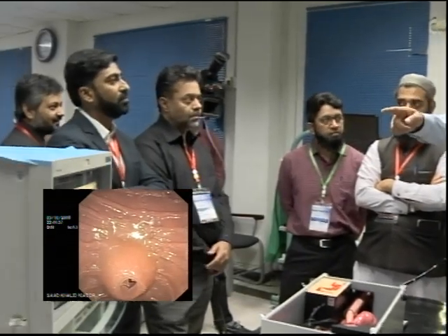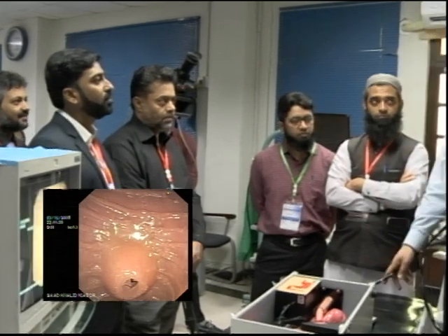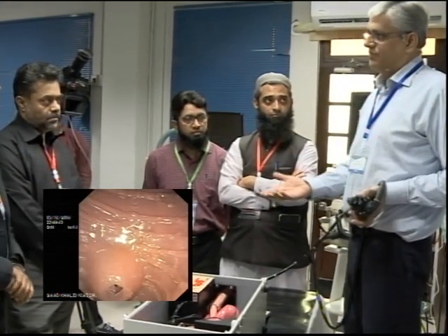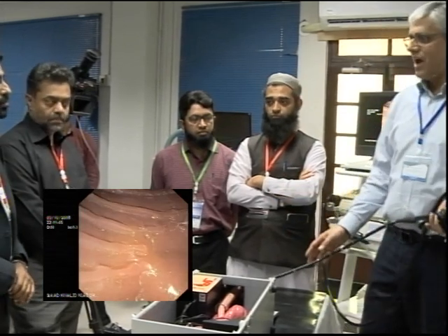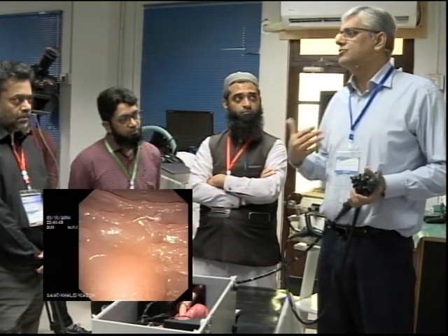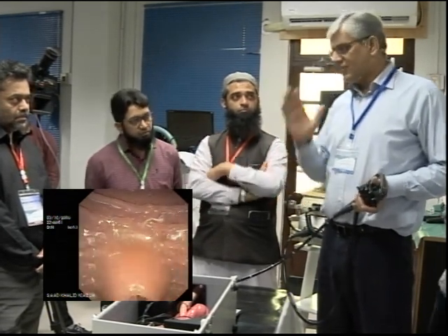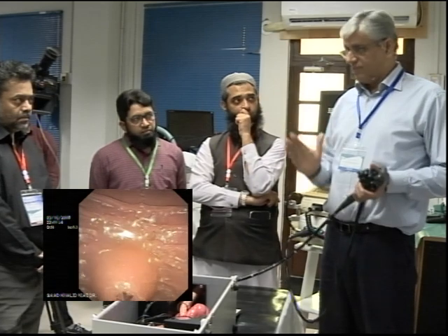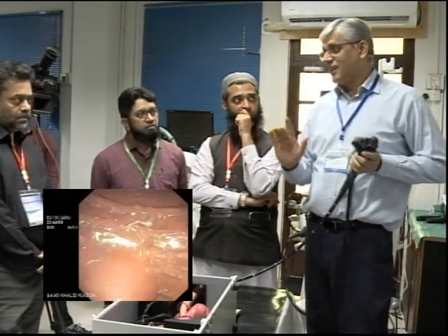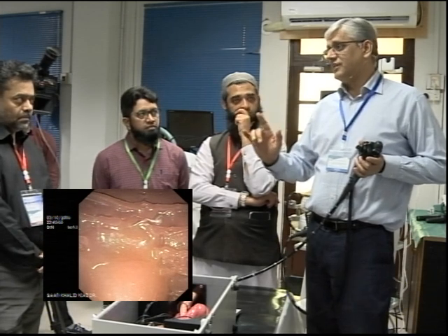Well, you see, if my screen is here, then I'll keep it here, and this is fine for me now. Why would I move? I would only move if I'm not getting something or if I'm trying to do something for which movement is necessary. Otherwise, once you've got it, what I tell my juniors is, now the position is in front, so please don't move now. Stop breathing.